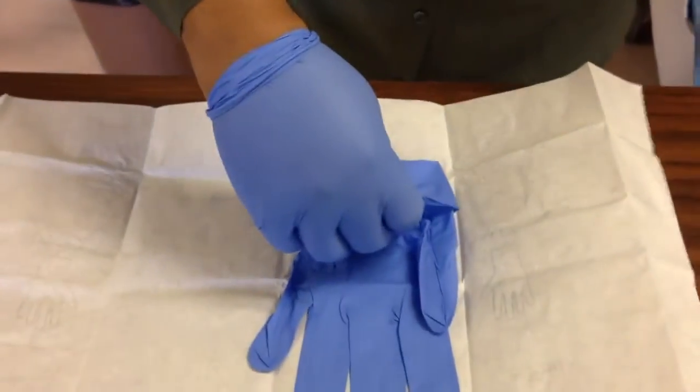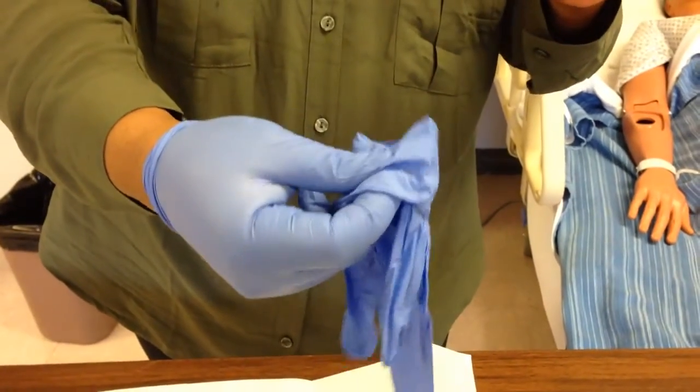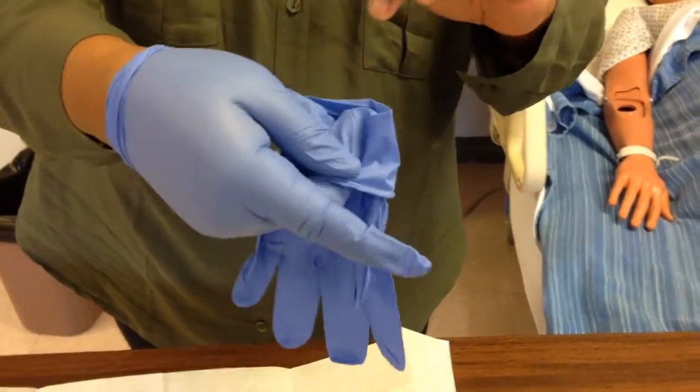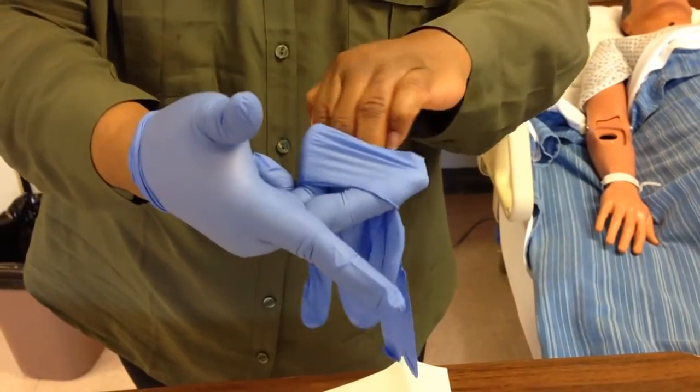I am now going to don the left, touching the cuff. I am going to carefully insert my hand and keep my thumb out of the way.